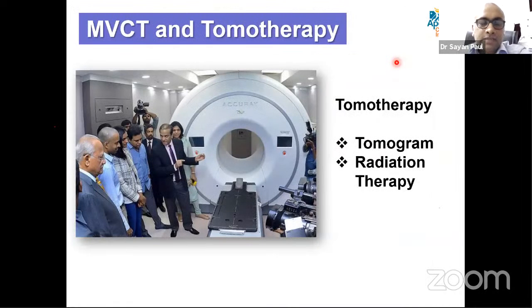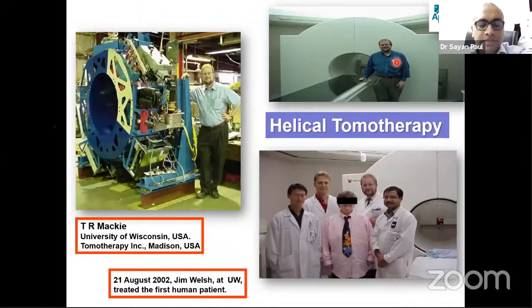The next one is megavoltage CT and tomotherapy. This is our tomotherapy machine at Apollo Hospital, Hyderabad. Tomotherapy means tomogram and radiation therapy. It was developed at the University of Wisconsin, USA, and they treated the first patient in 2002.